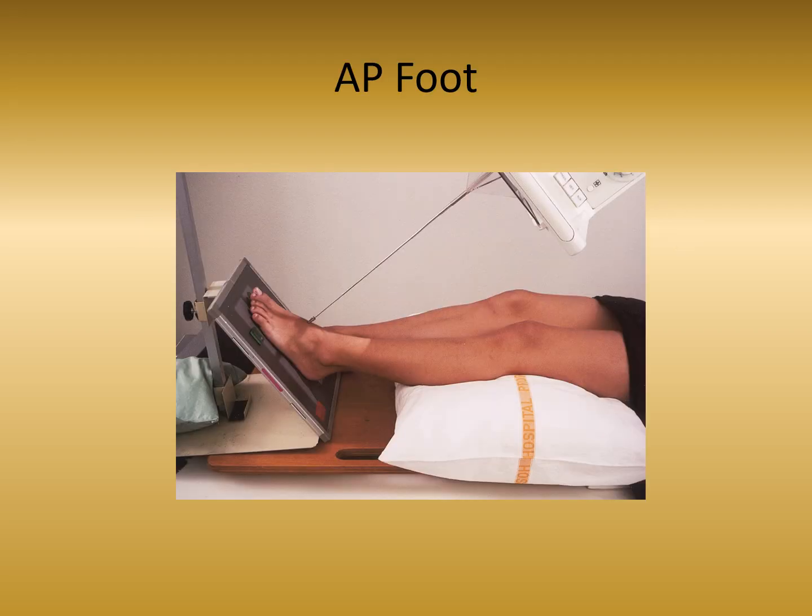This is an example of a trauma positioning of the foot. This not necessarily is always a trauma though. I mean, I've done a lot of foot x-rays like this where the patient was in the bed and unable to bear weight on their foot, or maybe they were someone who is unable to walk and wheelchair bound or bedridden. And you have to kind of get a little fancy with your positioning of the equipment.